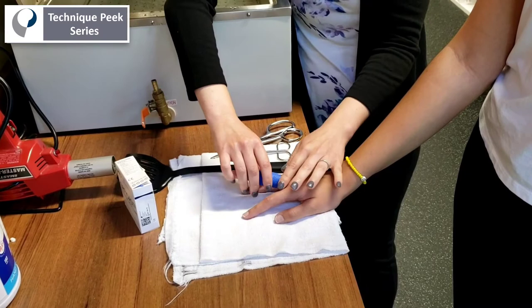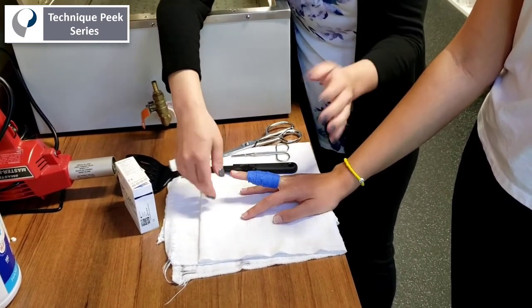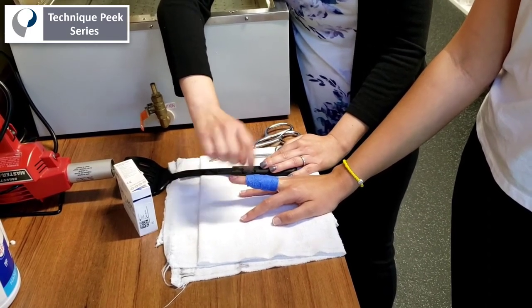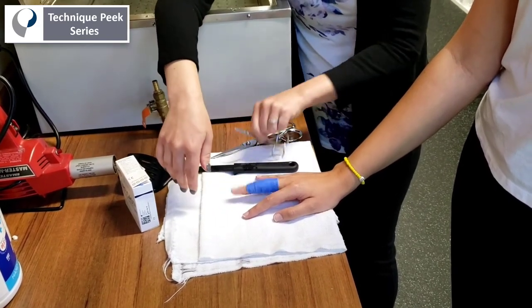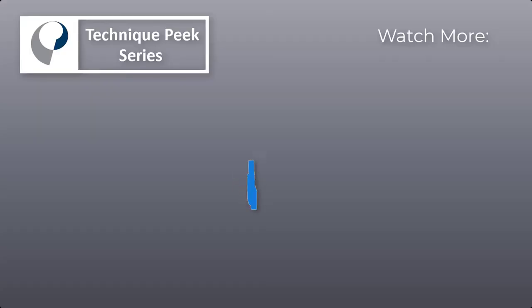This is really easy — much faster than traditional plaster casting, makes a lot less of a mess, and it's nice and smooth, so it's usually comfortable for the patient. Now it's hard like a regular cast, and it can either be slid on and off or cut with scissors in between cast changes. Thank you for your time.